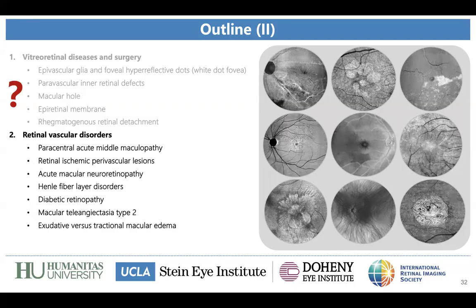Following the same line of thinking, there are many reading centers nowadays that use en face OCT to measure the area of the ellipsoid zone, for instance, for degenerative disorders such as retinitis pigmentosa.